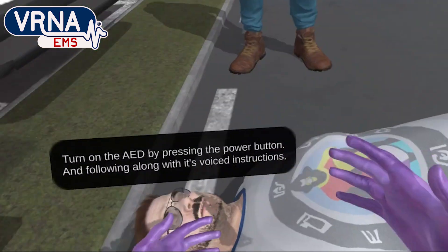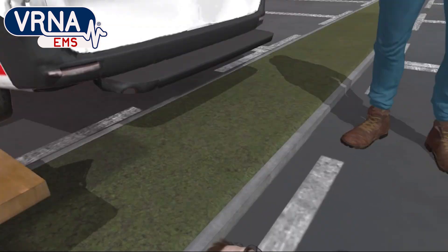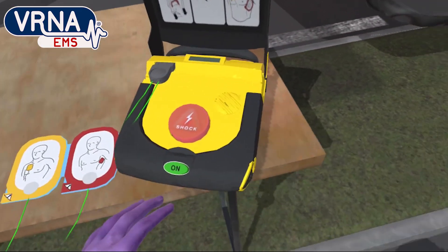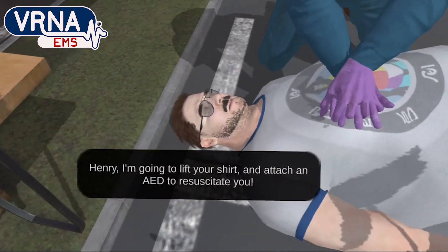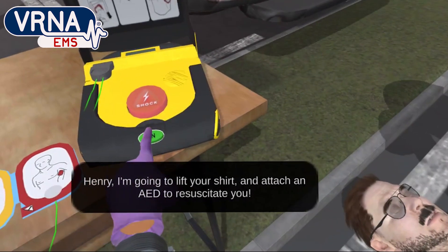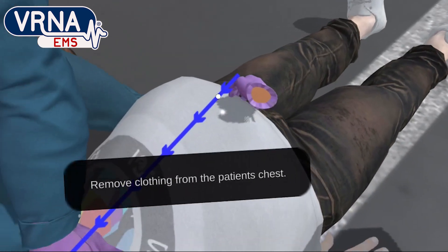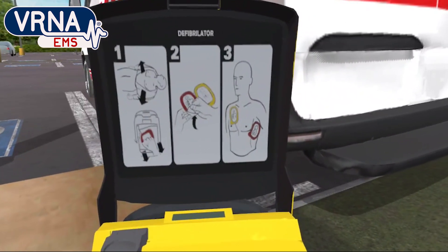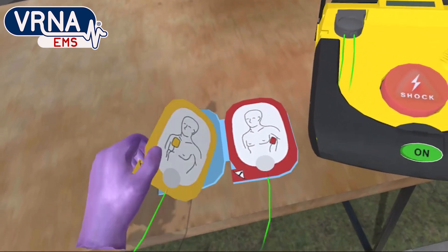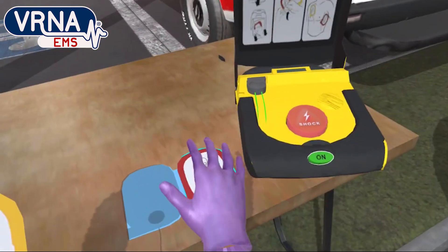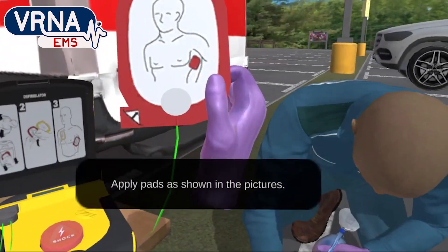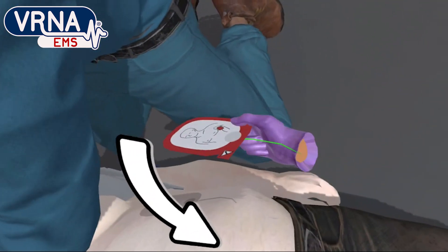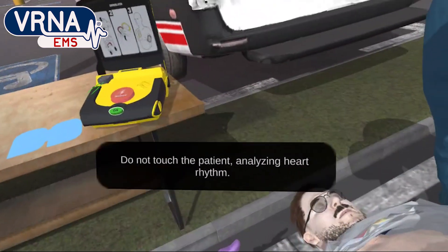Remove clothing from the patient's chest. Apply pads as shown in the pictures. Do not touch the patient — analyzing heart rhythm.